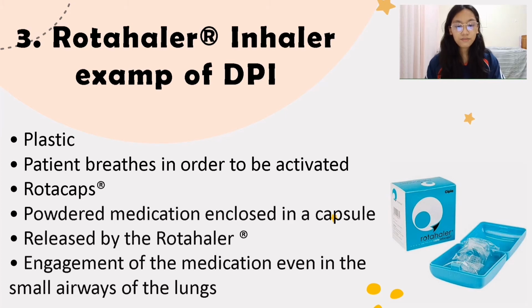Then, it provides an increased effectiveness in the medication when it is inhaled correctly that results in the engagement of the medication even in the small airways of the lungs. Like I have said earlier on the discus inhaler, the role of the pharmacist is very crucial on the proper counseling of the patient for him or her to correctly use the medication or the device effectively.